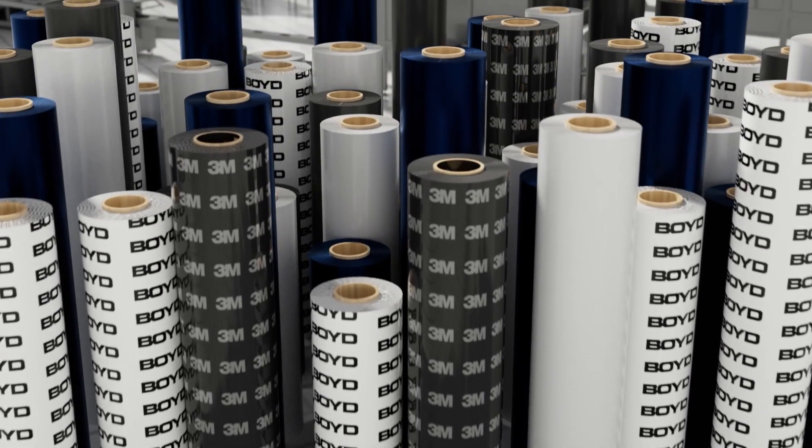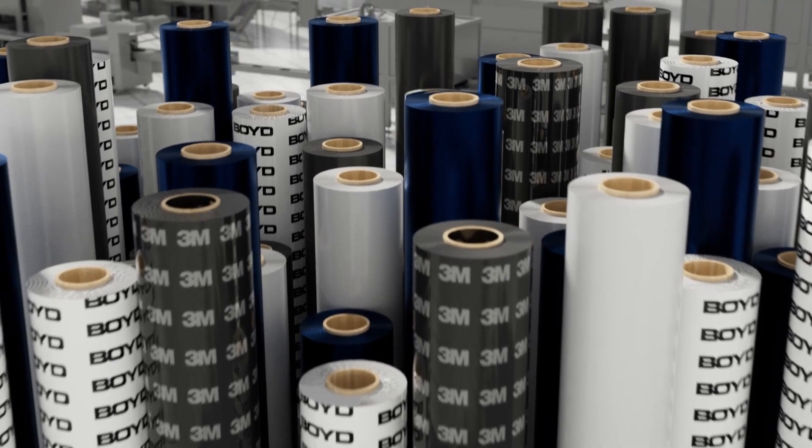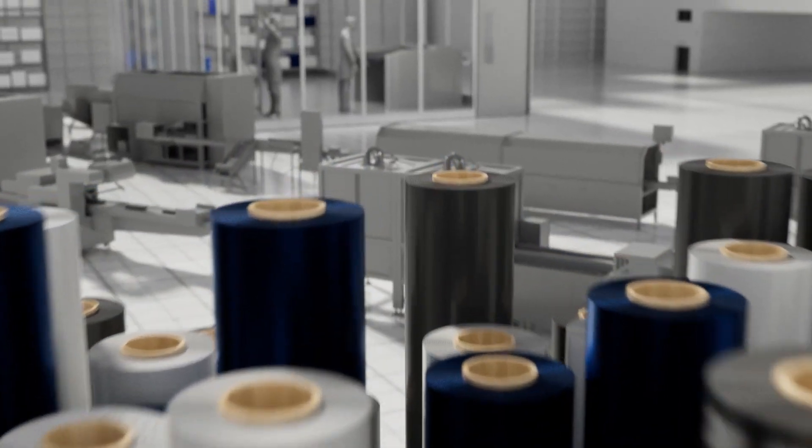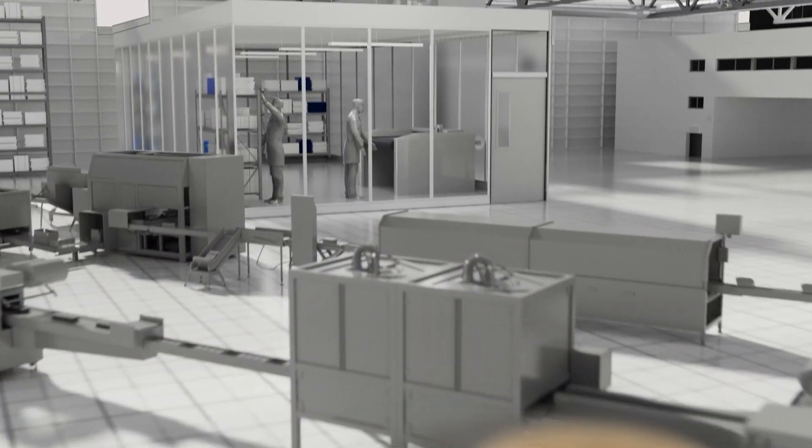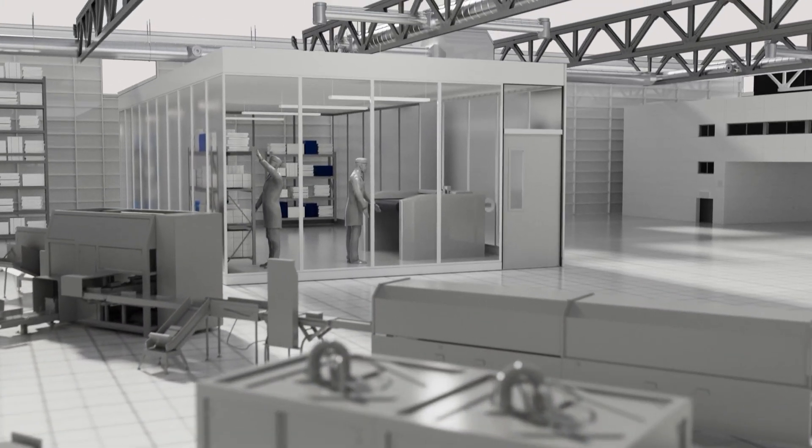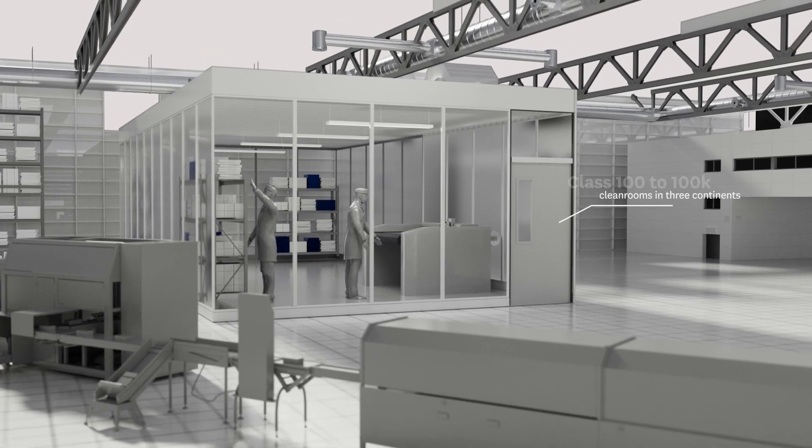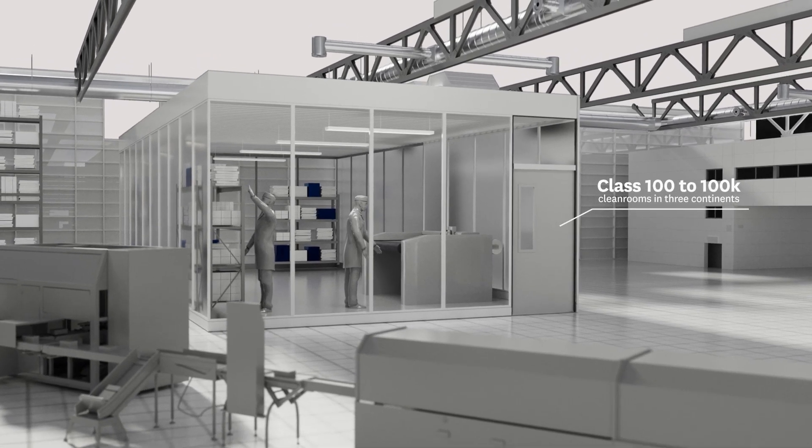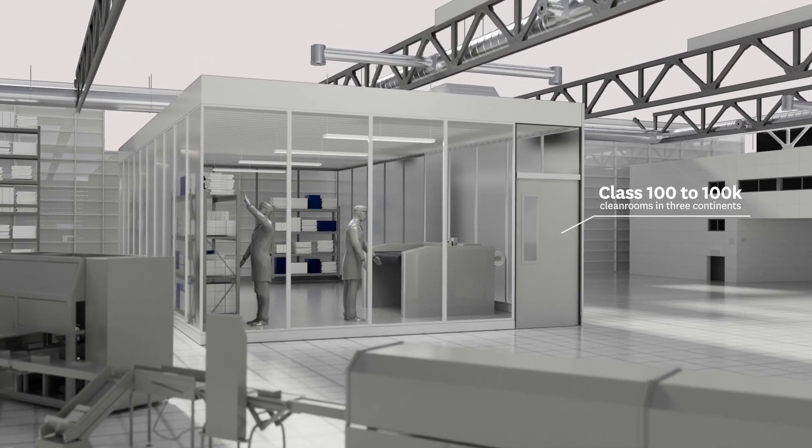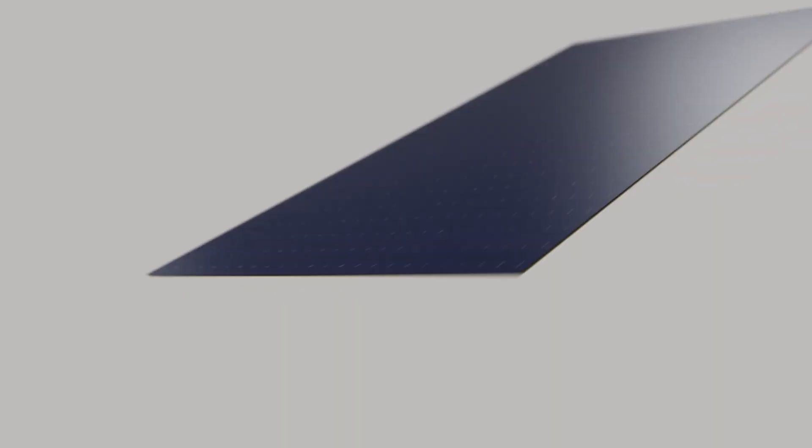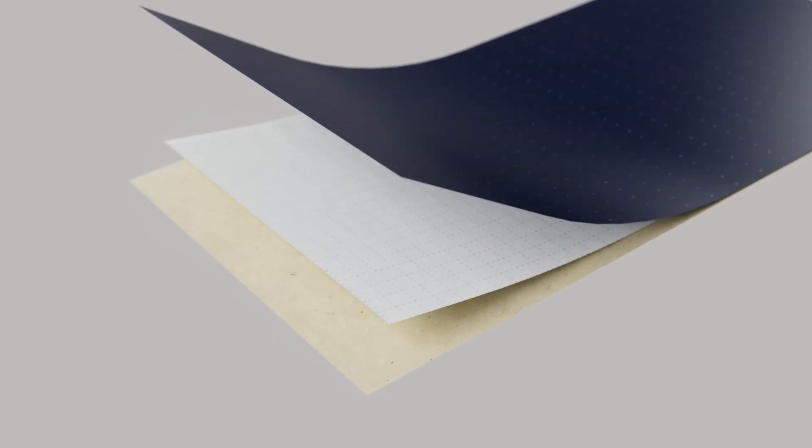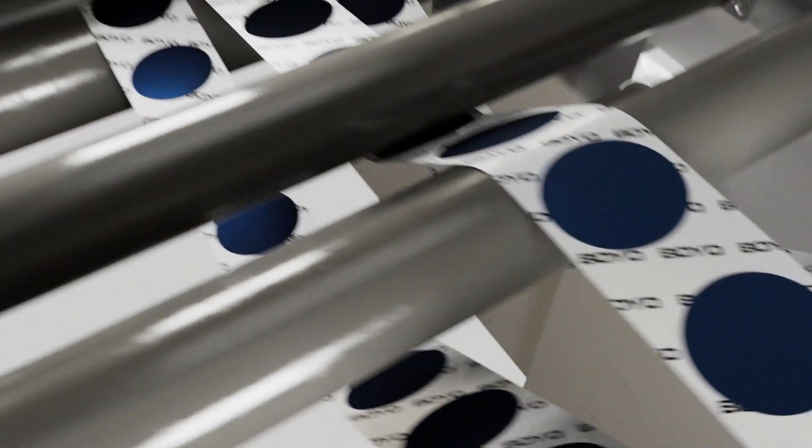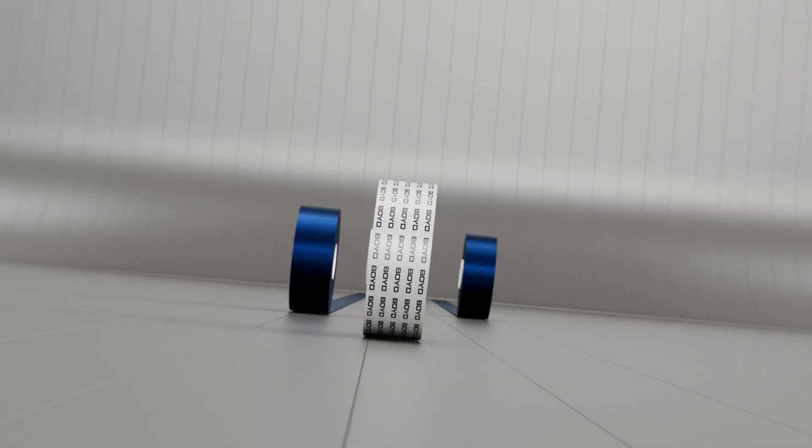Boyd engineers source the best materials for your application and design for manufacturing by utilizing state-of-the-art equipment in Class 100 to 100K clean rooms in three continents to laminate multi-layers, die cut, slit, and print liners.